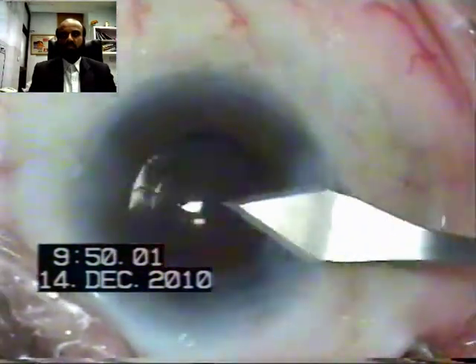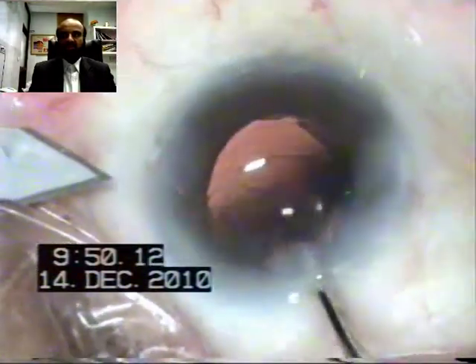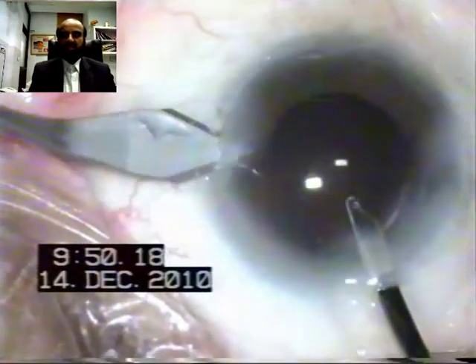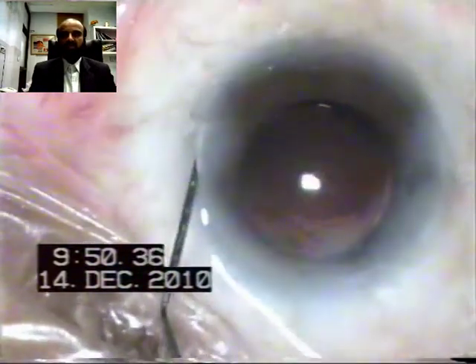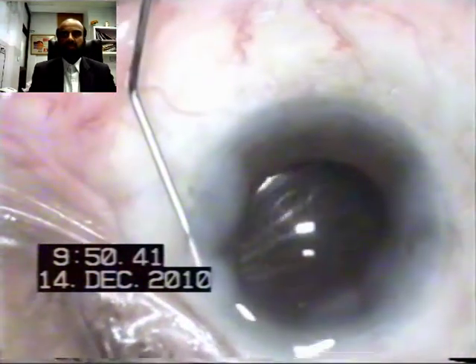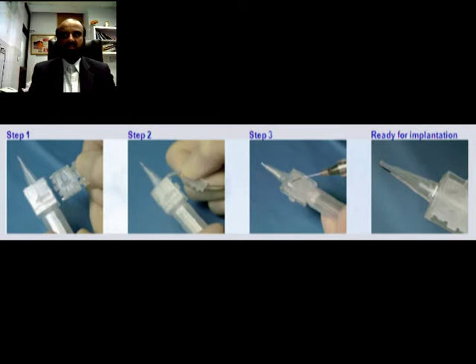There is an additional maneuver here to handle the pre-operative astigmatism, with the steep axis being at 180 degrees. The 2.75 millimeter incision is enlarged with the help of a 3.2 millimeter knife, and another cut is placed 180 degrees away. This little maneuver decreases the astigmatism from plus/minus two diopters to plus/minus one diopter postoperatively. Both incisions are again hydrated and the final result is shown.